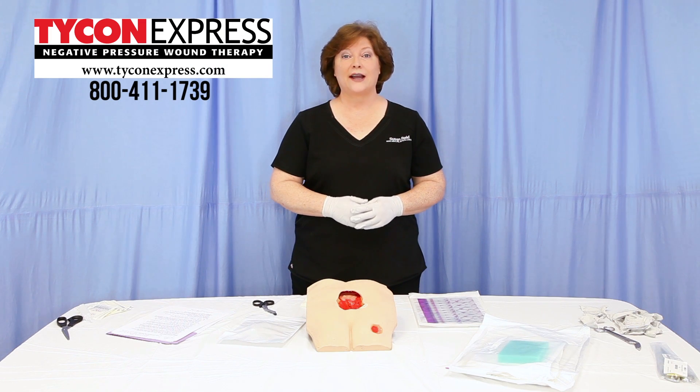Hello, I'm Susan Reed for Tycon Express. Today we're going to be covering the basic technique for a wound dressing change for a negative pressure wound therapy system utilizing a foam-based interface.